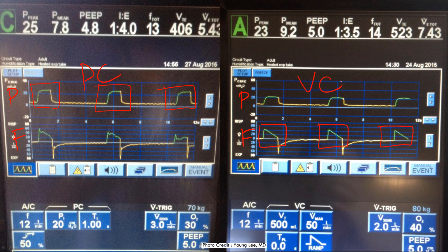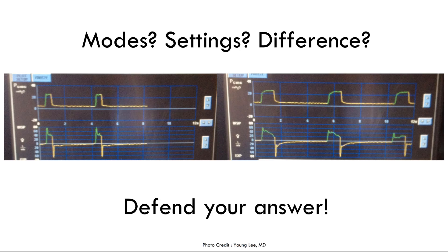Just by looking at the waveforms, we can determine: the left is pressure control mode and the right is volume control mode. You should be able to decipher what mode of ventilation the patient is receiving from the waveforms alone. Now here are two more waveforms — what is the mode of each patient, what are the settings, and what is the difference between them? Pause the video now.